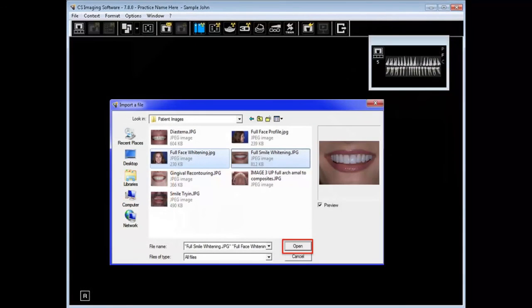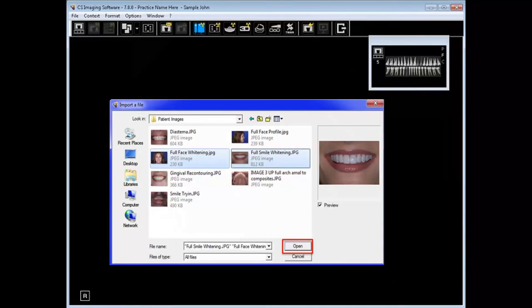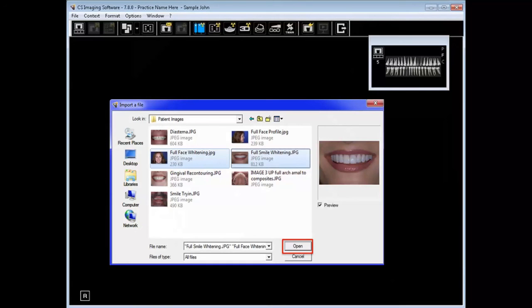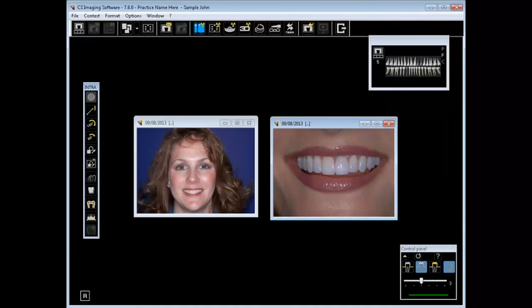If you choose to import from a file, the system will ask where the files are stored. In this case, they're in a folder called Patient Images. Hold down the Ctrl key to select random multiple images, and then press Open. The images are then imported into the software, and save the imported images with the steps previously shown for saving images.